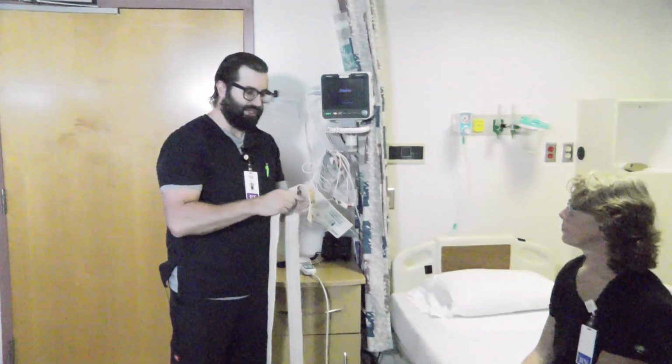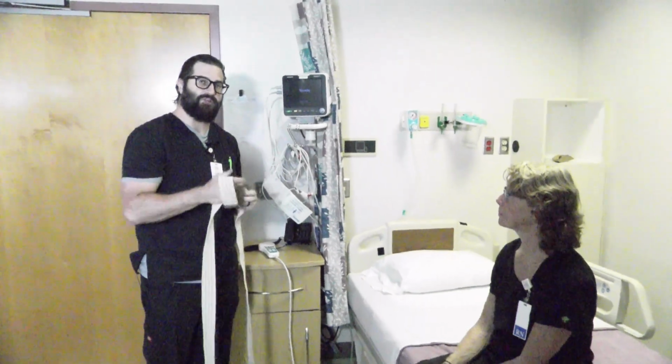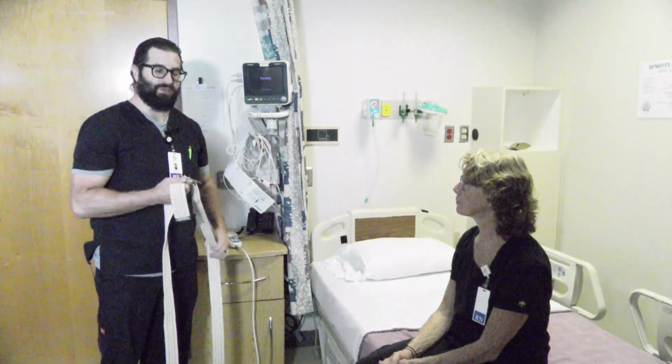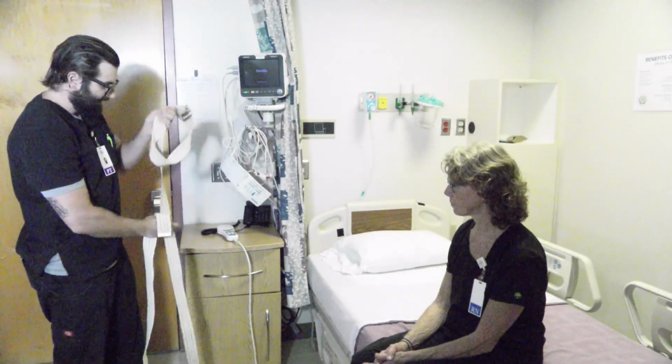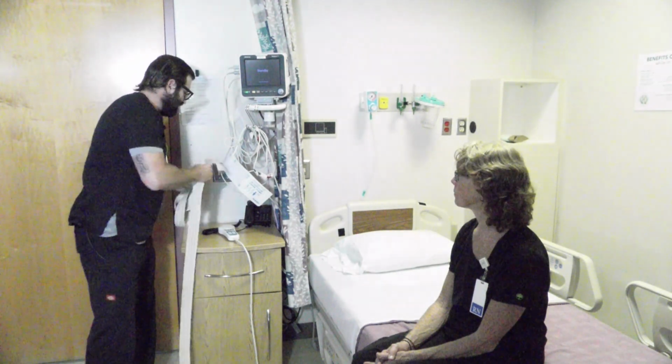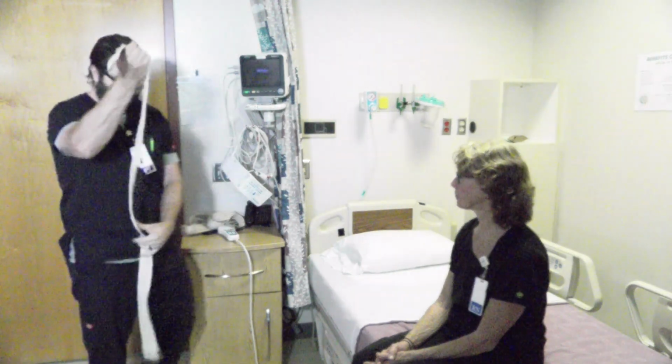I've got an individual here, Miss Patty, who is pretending to be one of our patients today, and so I'm going to demonstrate putting a gait belt on her, and we're going to do a sit to stand movement. So Patty, by the looks of her, needs a regular size gait belt, and that's what I'm going to use.